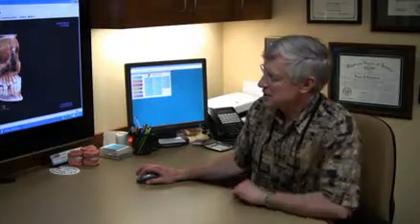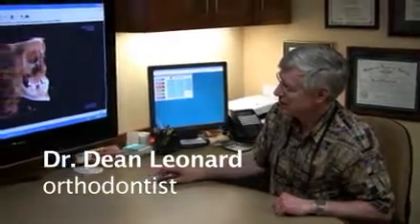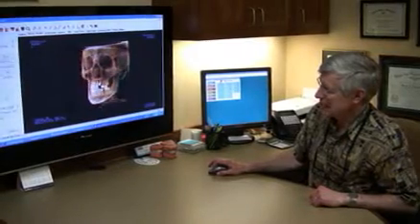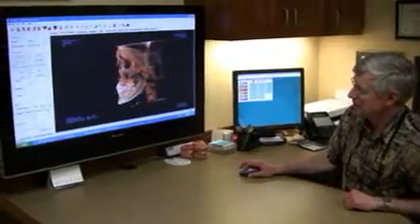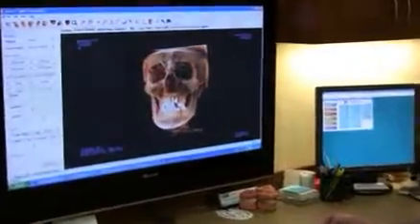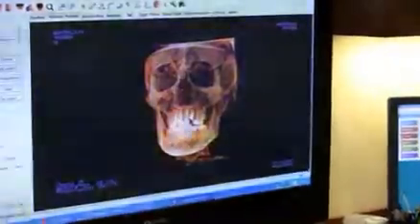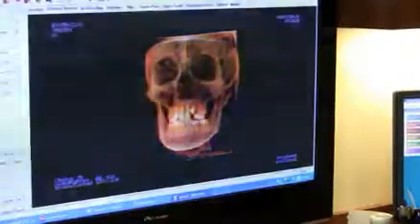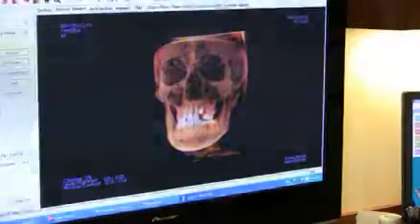Okay, so this is an example of the kind of radiograph that we're able to provide our patients. We've got 3D imaging so that we can look at the patient from any angle that we want, rather than just a two-dimensional film. We can also highlight certain things by moving the various aspects of the electronics that throws in filters.